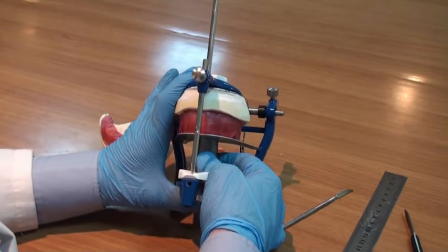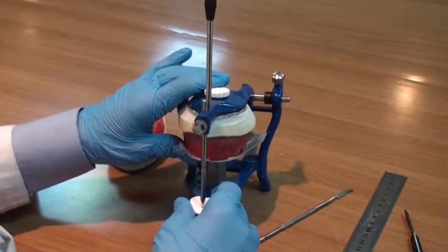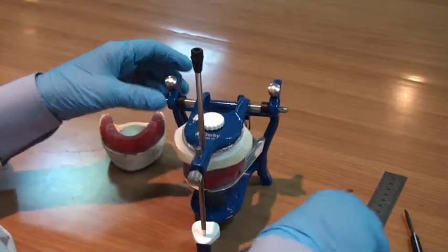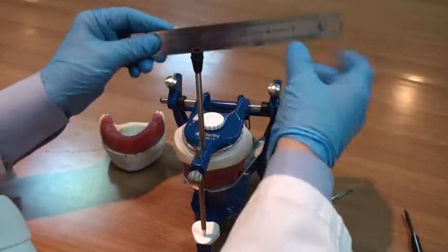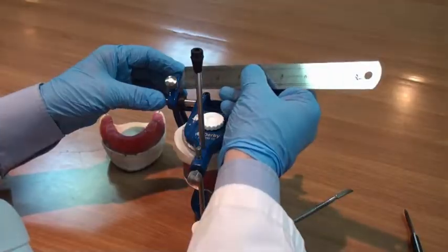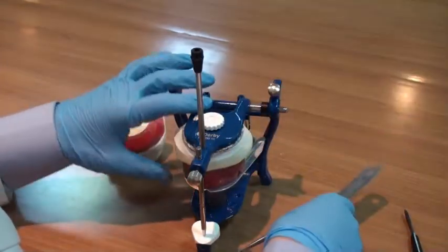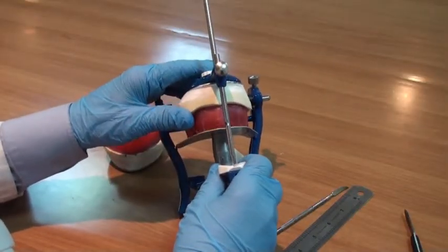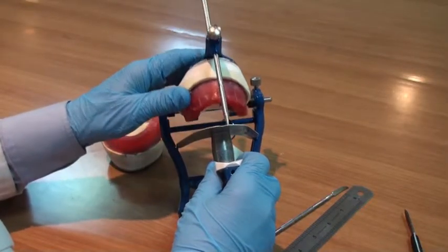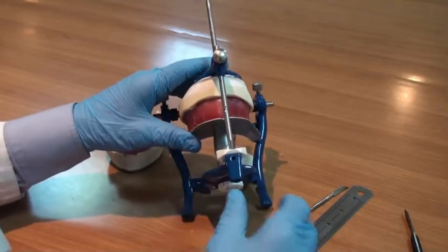Now, the occlusal plane placed here must have a relation with the intercondylar axis. Here we have the condyle and here a condyle, and in between we have an axis. It's called the axis of rotation, where the mandible will open and close in an arc movement around this axis.